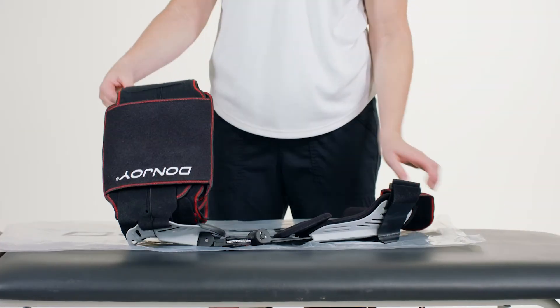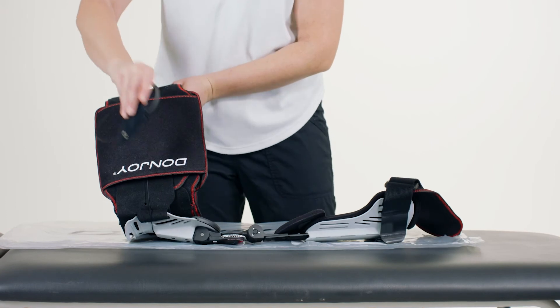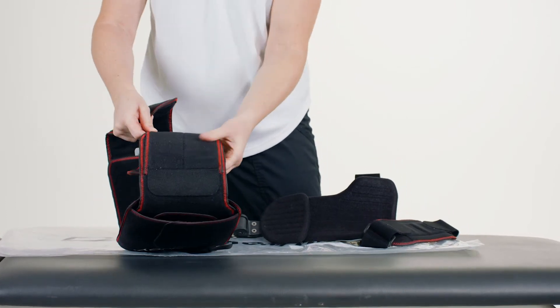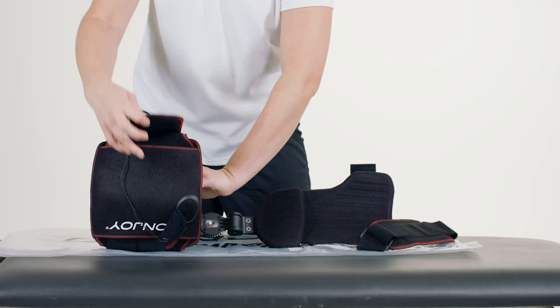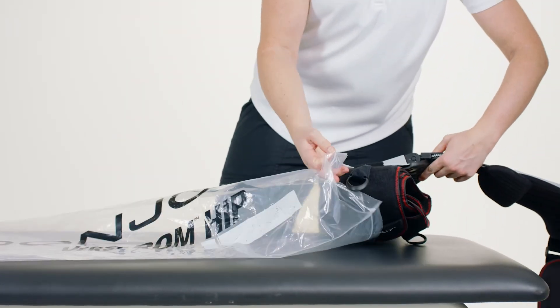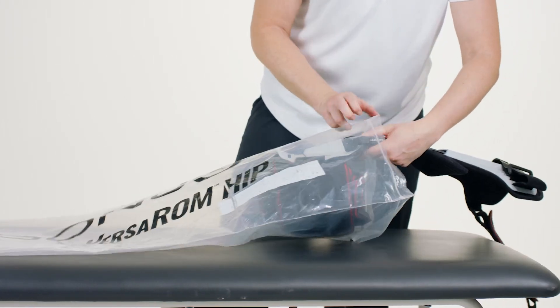To ensure the proper fit, if possible, the product should be sized on the patient preoperatively. Once the initial fitting is complete, do not disengage the waist belt or the semi-rigid shell. Rather, roll the waist belt up and gently place the brace into the bag.